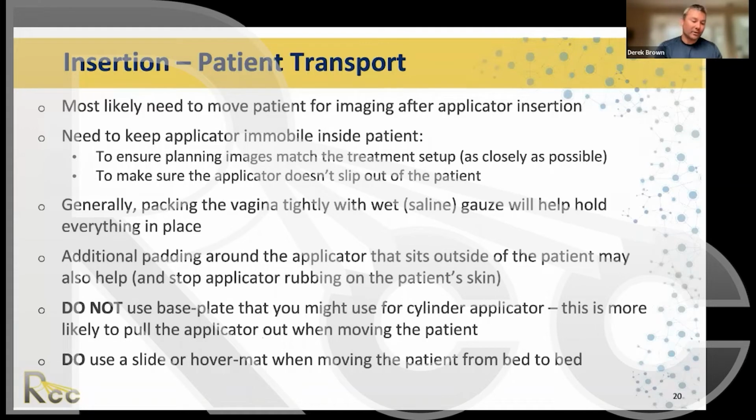So if the device moves inside the patient between when we image the patient and when we treat the patient, then we're going to treat them with the wrong dose distribution, right? So very, very important, and purely a mechanical thing here. We want to do everything possible, keep the patient as comfortable as possible, so that the device inside the patient does not change with respect to the anatomy of the patient.